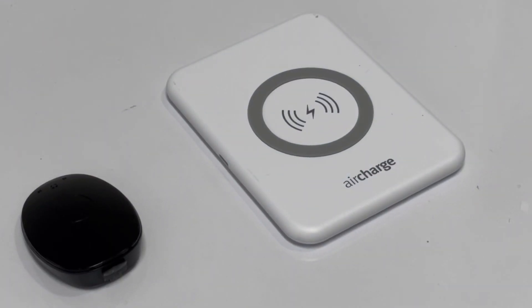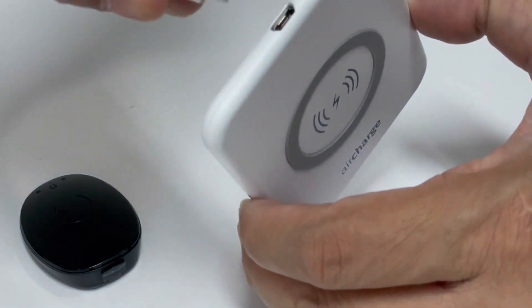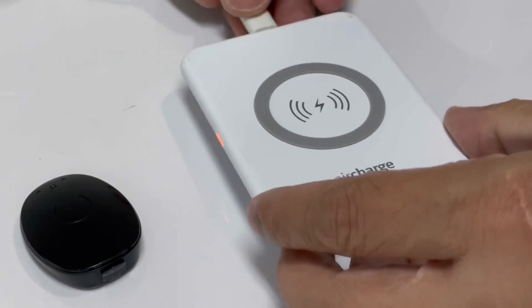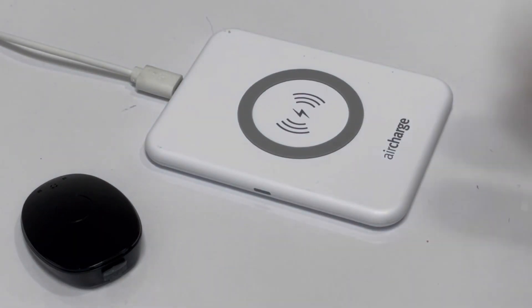First thing you need to do, you need to connect your key charger to your micro USB port. You will see a red indicator light or a blinking pattern light beside your charger.